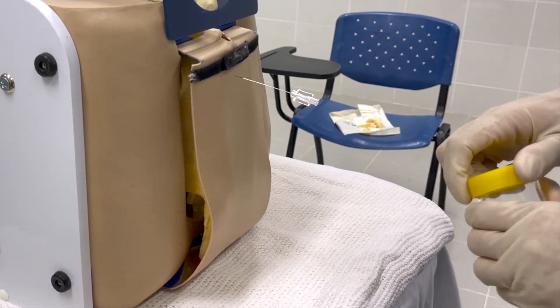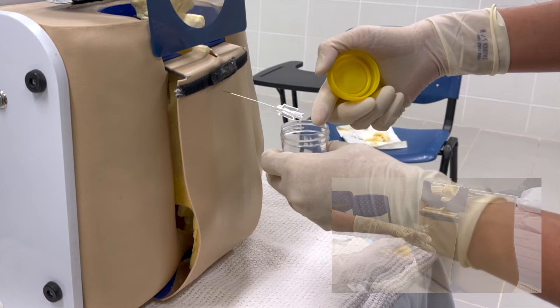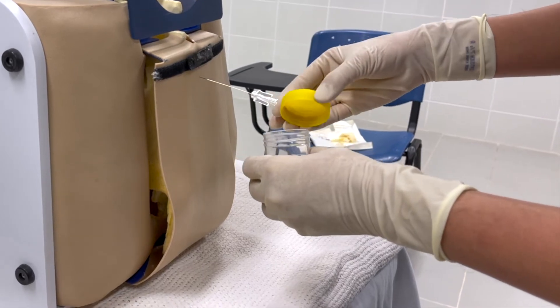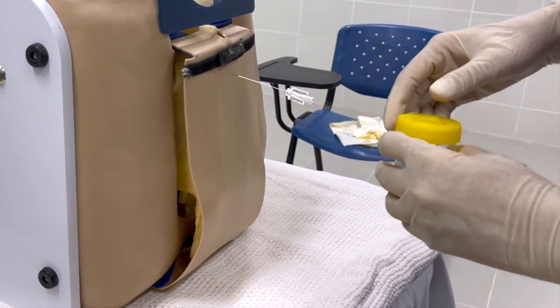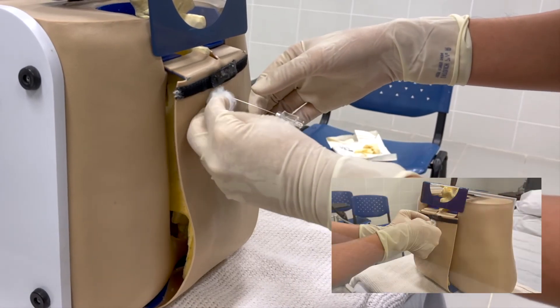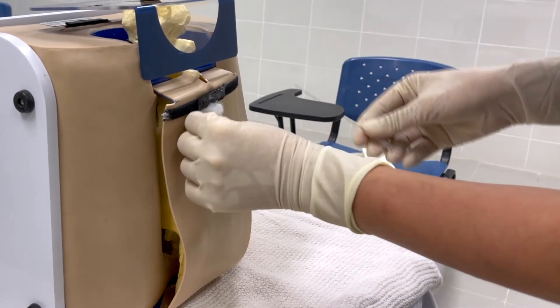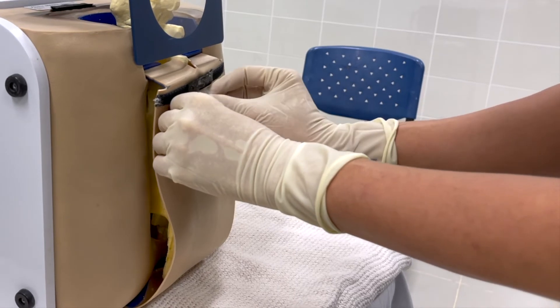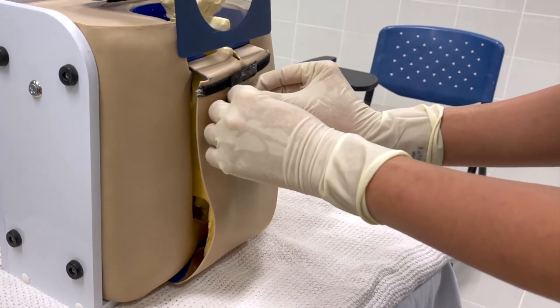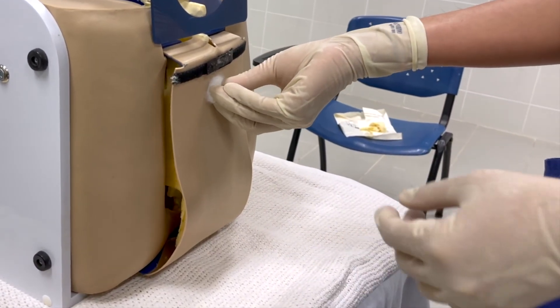After you remove the stylet, collect the CSF that is dripping out into the container — around 4 to 5 drops. It depends on what type of investigation you require; collect adequate volume for lab use. After collecting the specimen, gently remove the spinal needle. Make sure the bleeding is stopped — apply pressure using cotton wool to stop any minimal bleeding.